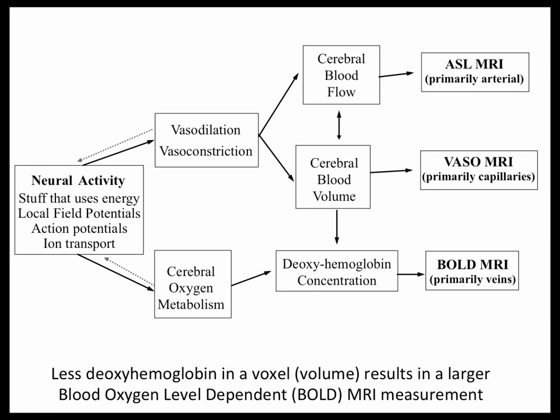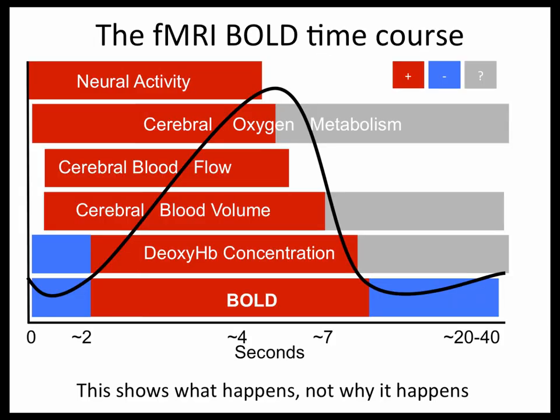So the practical applications are not quite as wide as BOLD. People like BOLD because it's really easy to do in a lot of different ways. These two methods have some really powerful studies behind them, but they're a little bit trickier. So next, I'm going to show this same flow chart, but over time, to give you a sense of what this BOLD response looks like.